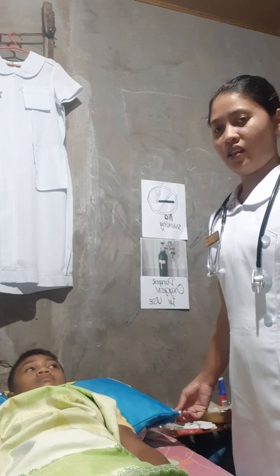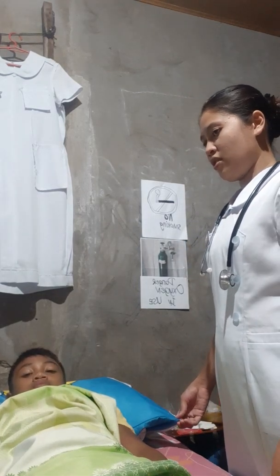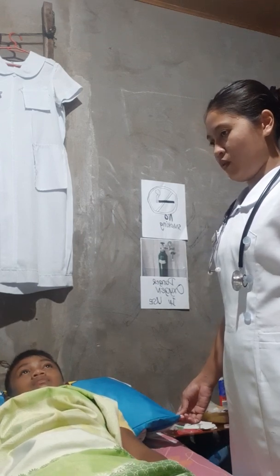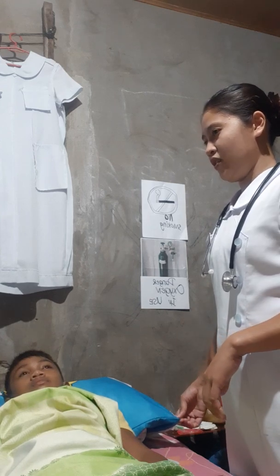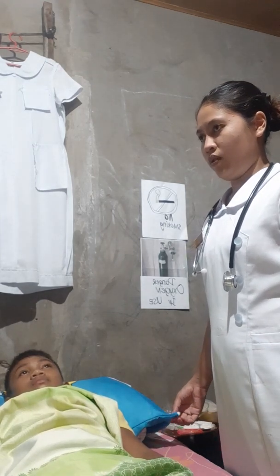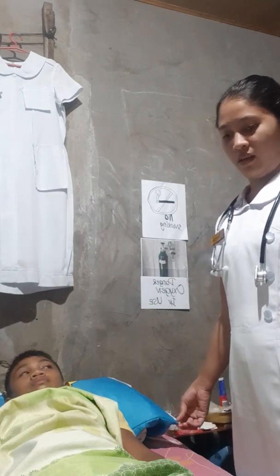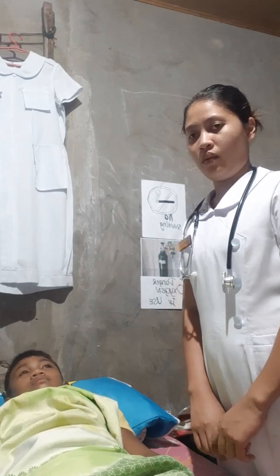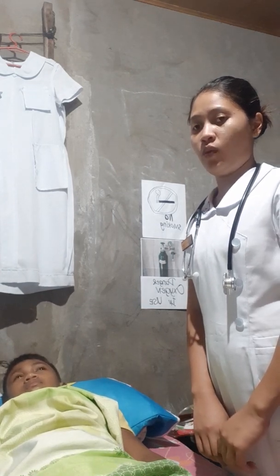Then explain the procedure. This procedure is oxygen therapy using face mask. This will help you breathe more than the cannula can help you. So, more oxygen for you. It helps you to breathe easily. Next, explain why we are doing this and what we are going to do to the client.